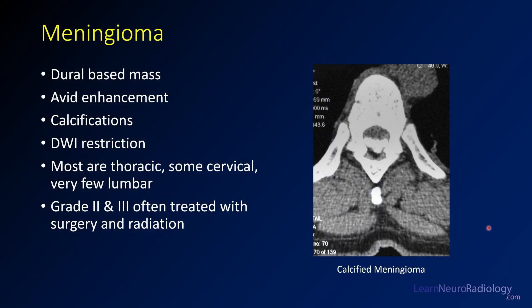Meningiomas are dural-based masses. They typically have avid enhancement, and it's pretty frequent to have calcification. On diffusion-weighted images they can have restriction because of their tightly packed cellular components. Most occur in the thoracic spine, though you'll have some in the cervical and lumbar spine as well. They come in three grades — grade two or three will often be treated with radiation after surgery. Here you see a calcified meningioma on CT: along the dorsal margin of the thecal sac, a densely calcified mass.